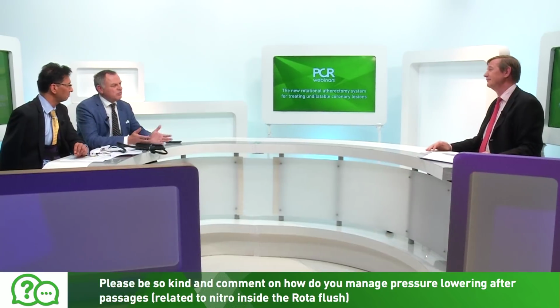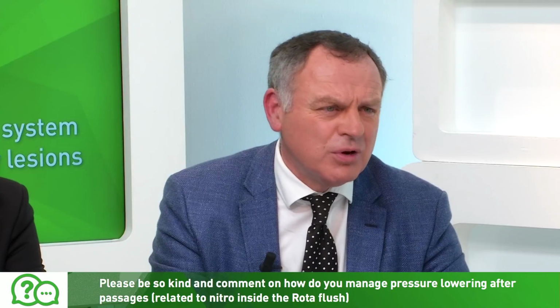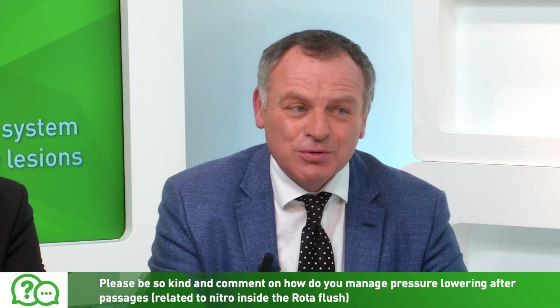Another comment that I could say is that for patients with poor LV function, normally, rotablation is quite contraindicated. So I will say that if you have to face a complex angioplasty with a patient with a poor LV function, probably if you can avoid rotablation, it's better.